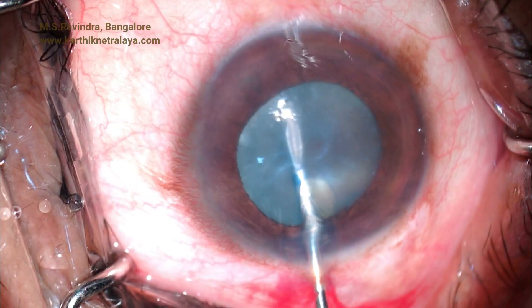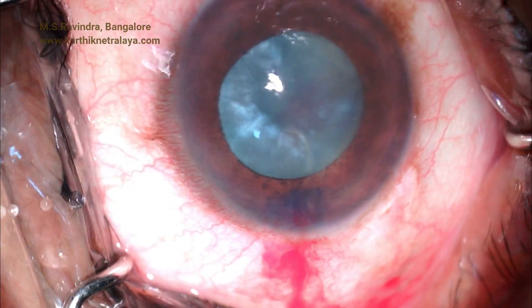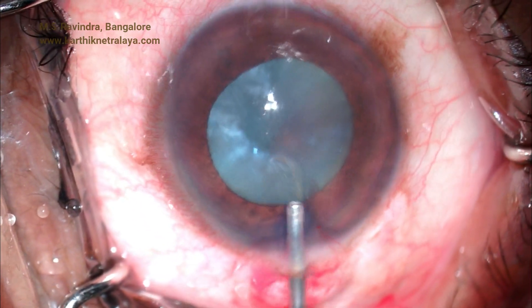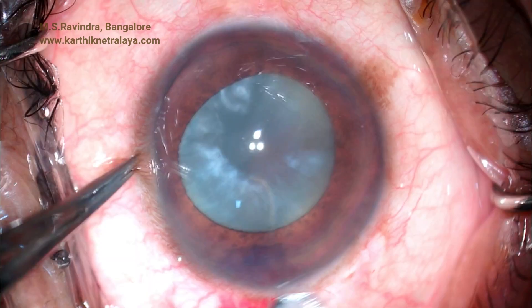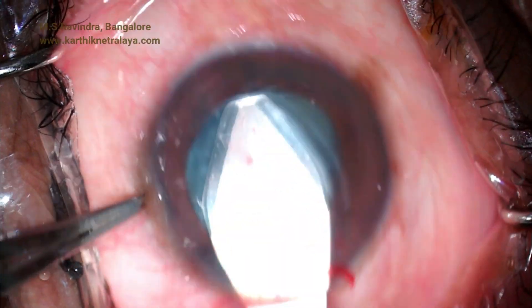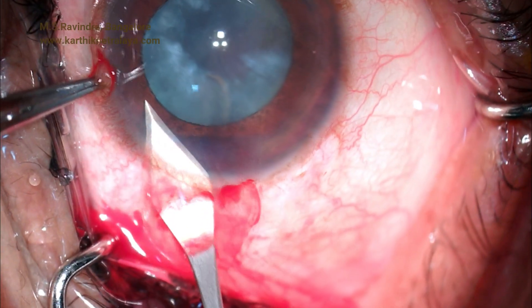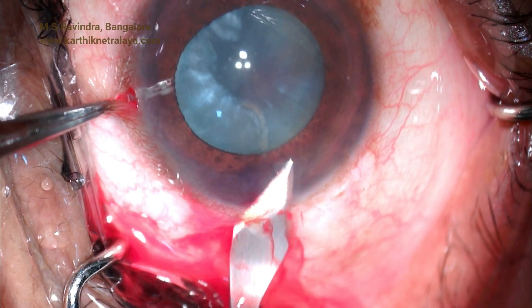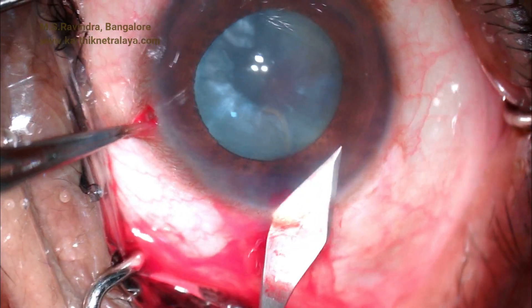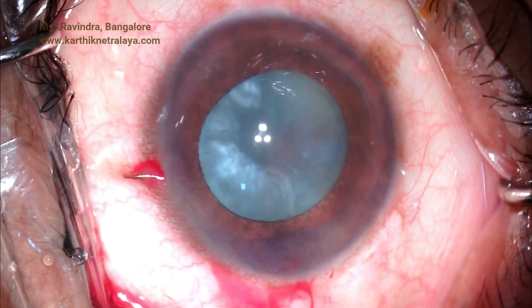A thick-bore needle is passed through the tunnel, the anterior capsule is punctured, and the liquid cortex is quickly aspirated. Viscoelastic is re-injected into the anterior chamber and the tunnel is enlarged. A trapezoid tunnel is created so as to minimize damage to the endothelium while the nucleus is being removed.